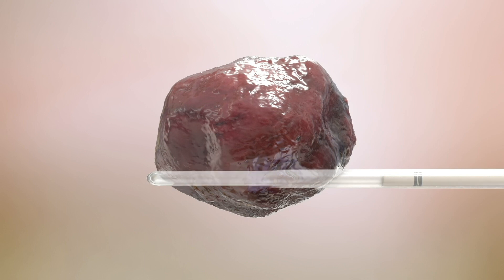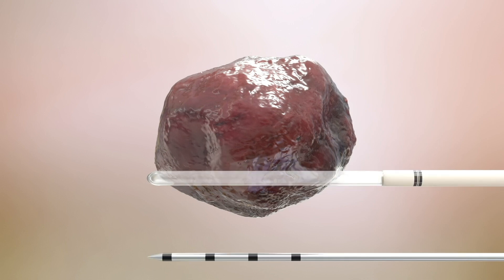A temperature probe is then placed parallel to the applicator at the lateral edge of the desired margin.